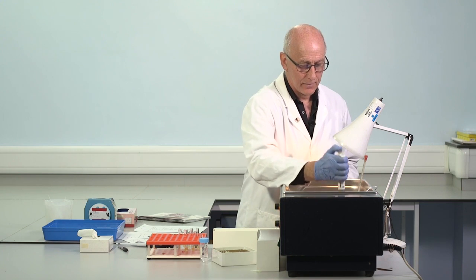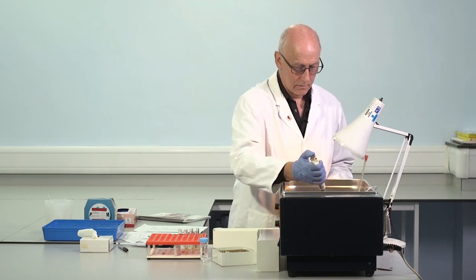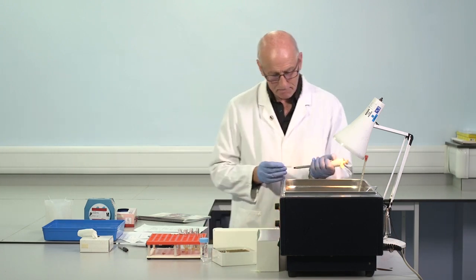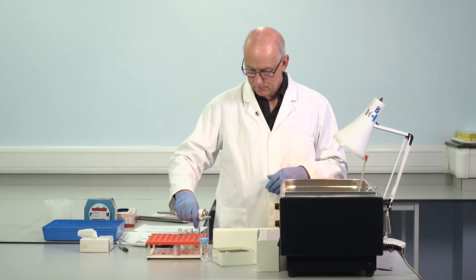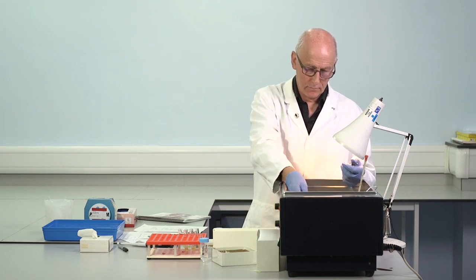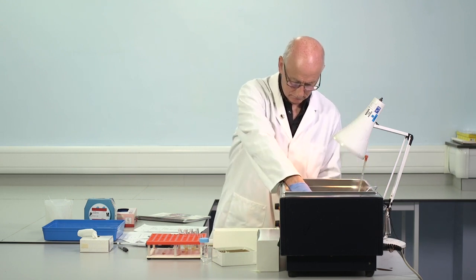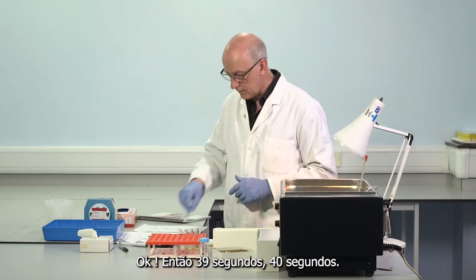Okay, 3 minutes. Calcium. Patient number 1. Okay, so 39, 40 seconds.